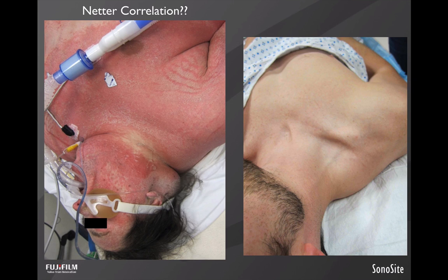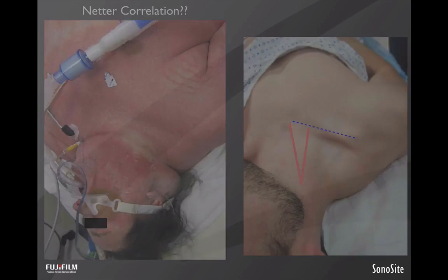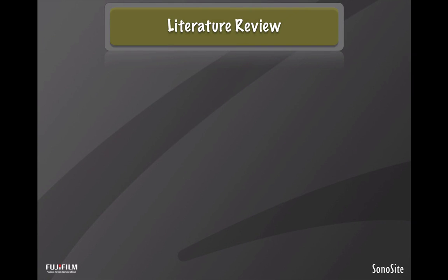And what's great is ultrasound gives you that anatomy. It allows you to overcome the intrinsic flaw of adipose, the intrinsic flaw of abnormal anatomy, and gives you a clear view every time because you have this amazing tool in your hand. So again, in this patient, even though I can't see anything, I can pretend I can because I can visualize her IJ or carotid.